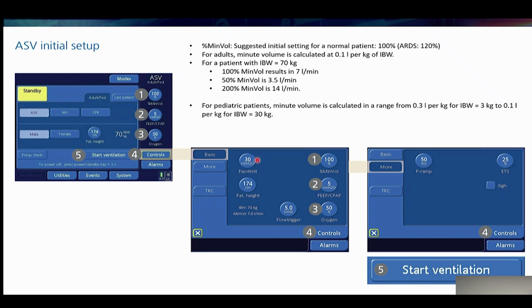What is this? The upper limit of the pressure that it's going to give, AKA maybe my upper limit pop-off valve? Yeah. Ours is a set limit, and our pop-off valve is 10 above it. Exactly. So the machine tries not to go above a pressure of 30 to get the minute volume that you want. It tries not to drive in more air than 30, and the pop-off valve, like he said, is 10 above this. So a good guideline to set it to is 30.